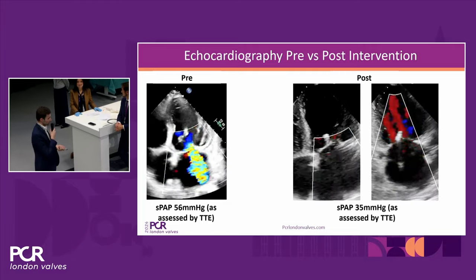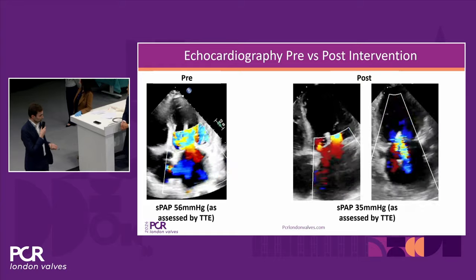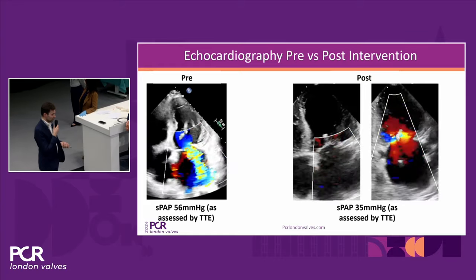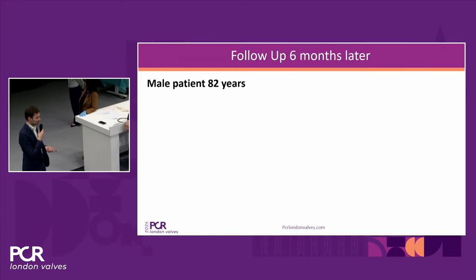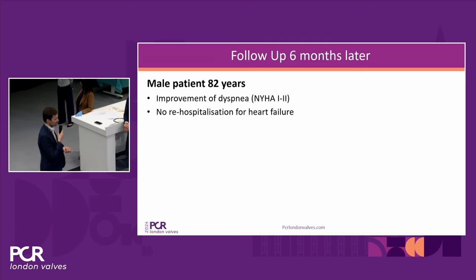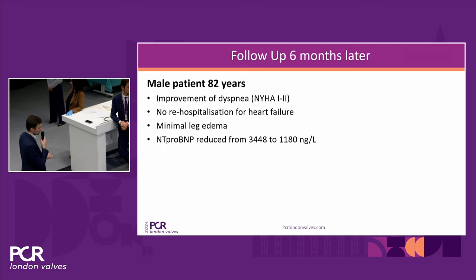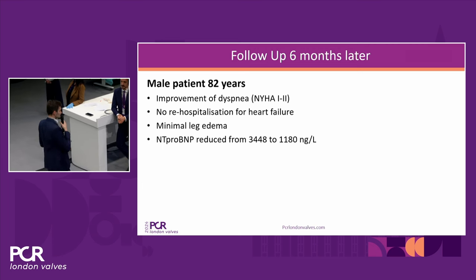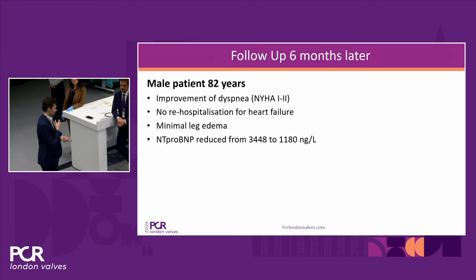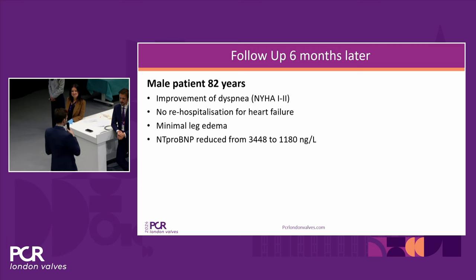You see here the picture before and after, the SPAP measured by TTE improved, and also the patient was doing much better now. So he was tolerating now a higher dose of medication, so his dyspnea improved. He had no more heart failure hospitalizations. He had only minimal leg edema. And also his NT-proBNP improved. So I think we made the right decision, but we can discuss that, to leave just one device there with having a residual MR of grade 1 or 2, but a gradient of only 4.